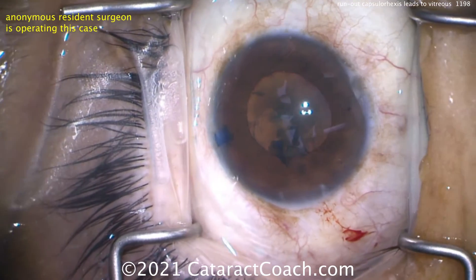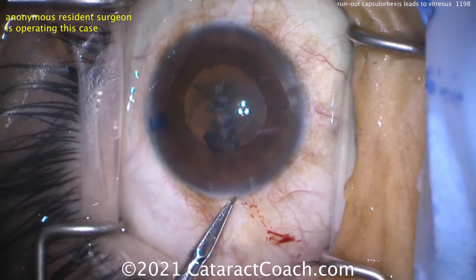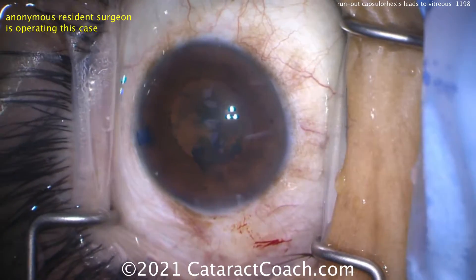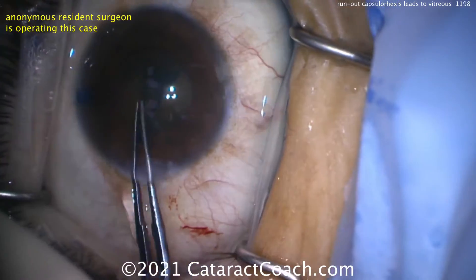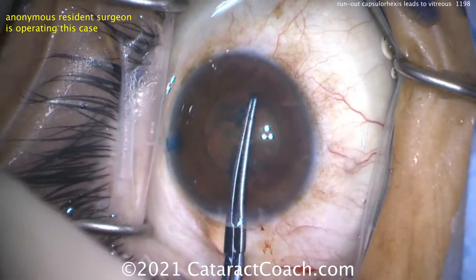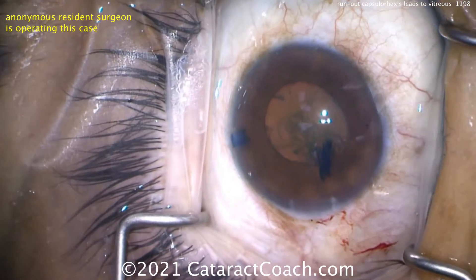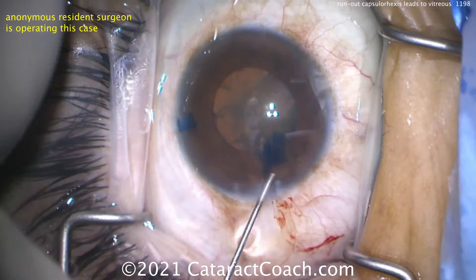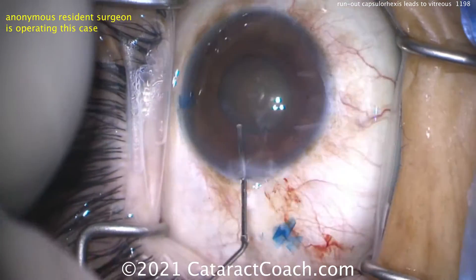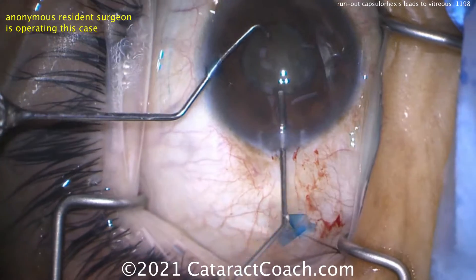Let's see what happens next. Vannas scissors — maybe not, maybe just the forceps again. There's the capsular rhexis being brought around. So we have the one area that's run out, which is in the sub-incisional space. That makes it tough because you can have it zipping around to the equator of the lens and then the posterior capsule, leaving you with a wide open posterior capsule.